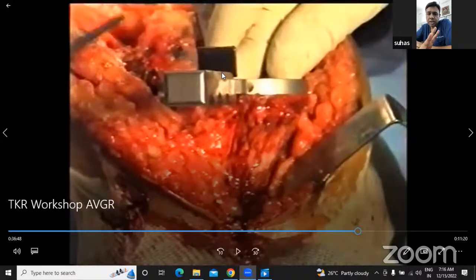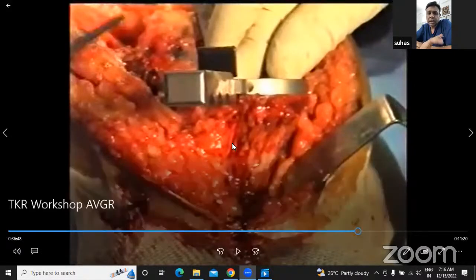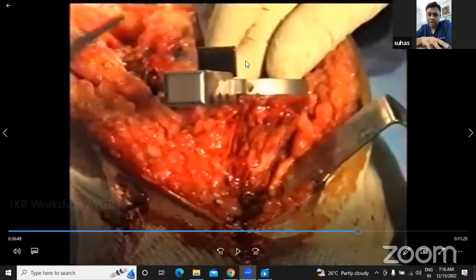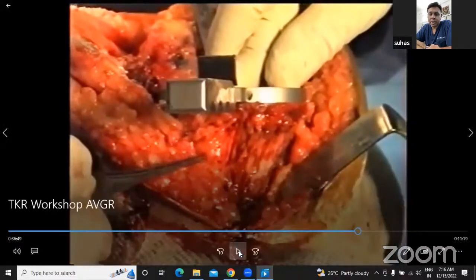So rotation is based on three things, like how we said last time. One is the Akagi line. Two is floating method, where once you trial, you flex extend the knee successively 3 to 4 times, where you're letting the tibia and femur decide how they want to sit. And the third is you can align it to the lateral border of the anterior aspect of the tibia. These are the three landmarks that are used to rotate. And again, one is not better than the other. And always it's a confluence of all the three methods for you to decide your correct external rotation. If you want to err more on the side of rotating it externally.